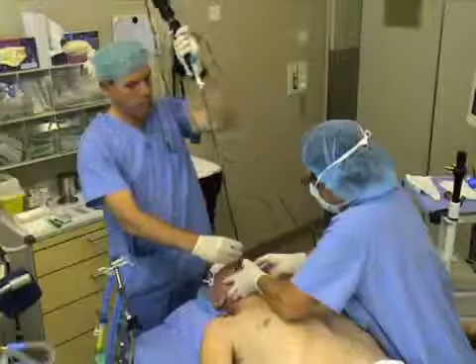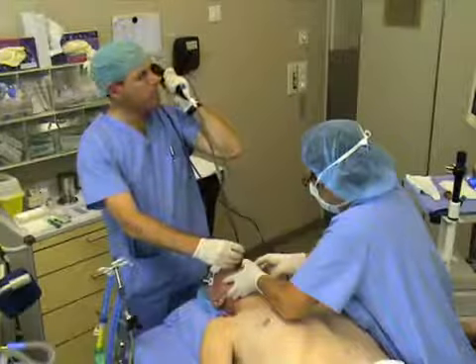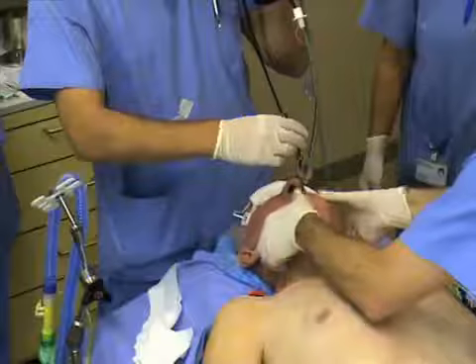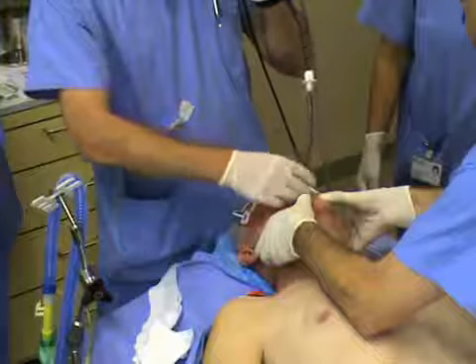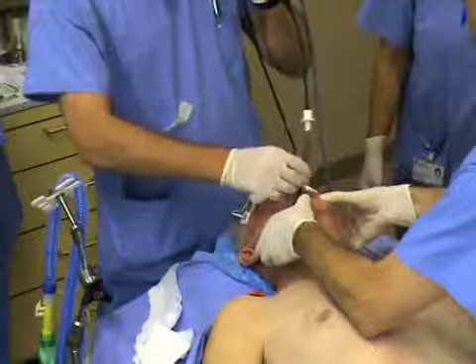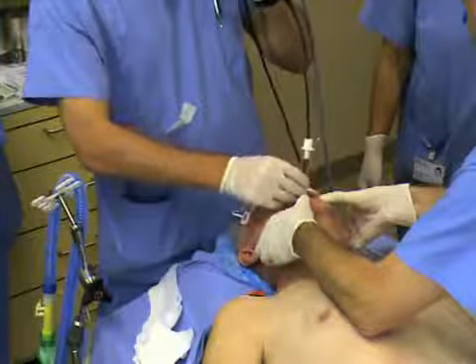Insert the fibroscope at the midline and follow the posterior wall of the oral airway. The end of the epiglottis can be easily recognized as you proceed. Advance the fibroscope through the glottis just above the carina, as demonstrated previously. When the insertion of the fibroscope has been completed, remove the slit oral airway and advance the flexible tube using rotating movements while maintaining the chin lift and jaw thrust maneuver.